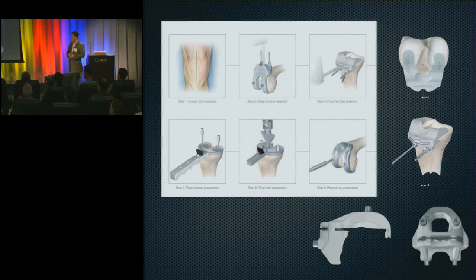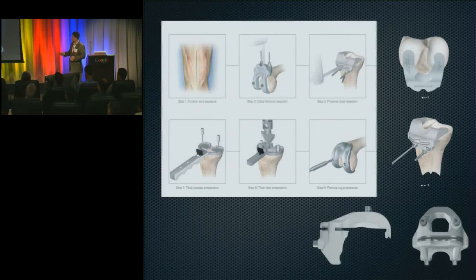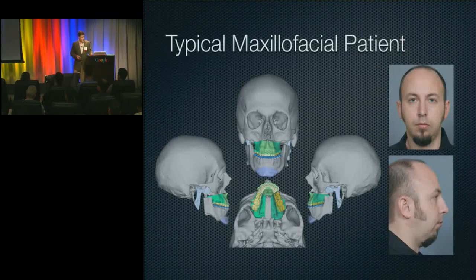So take what is a fairly standard procedure for a knee replacement, which involves cutting pieces of bone to fit these implants. Working backwards from the implant, we create the osteotomies, or the bone cuts that are needed, and use plastic guides, and sometimes metal-inserted plastic guides, guiding those perfectly positioned, pre-planned movements during surgery. This can not only save time, but more so than saving time, make something like a knee last longer, which really is the big cost.